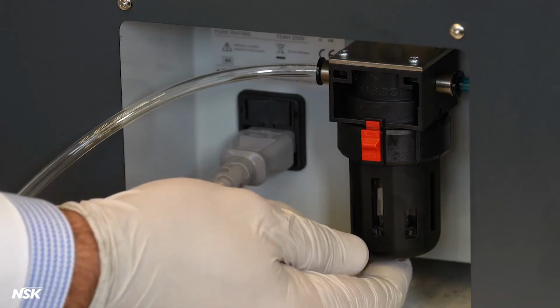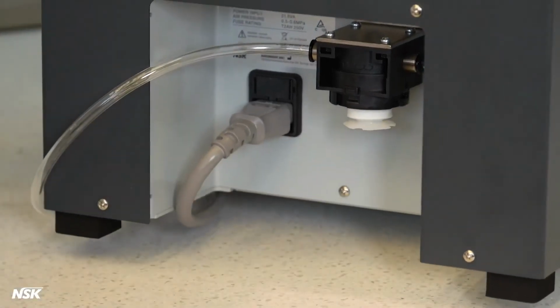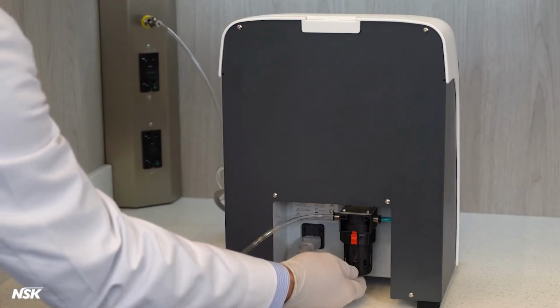Check the filter regularly to make sure it's empty and dry. We recommend changing the air filter once per year to ensure smooth operation. Before changing the air filter, make sure the air valve is closed and empty the remaining air in the line by pushing the air release button.